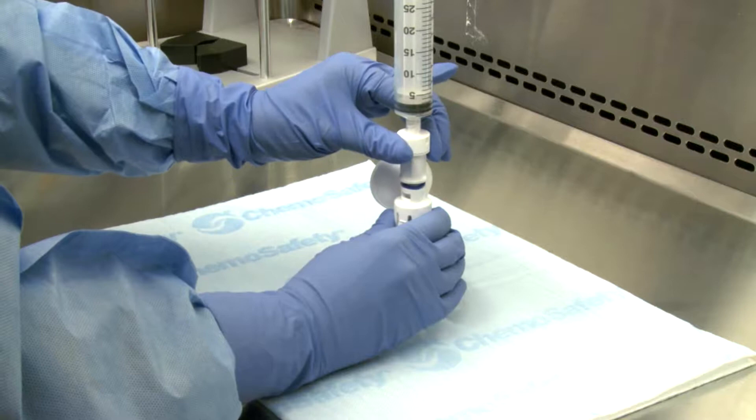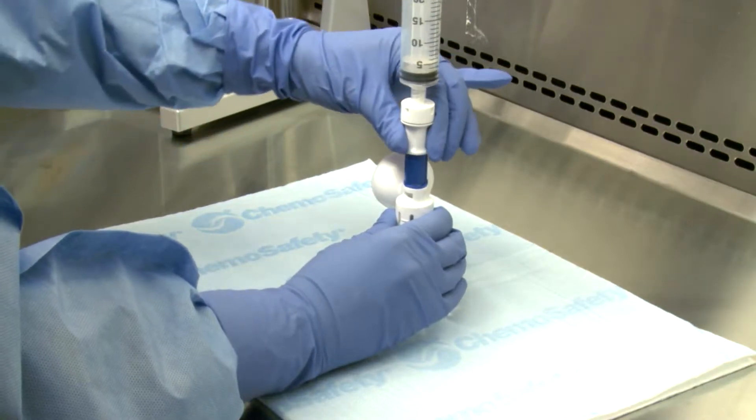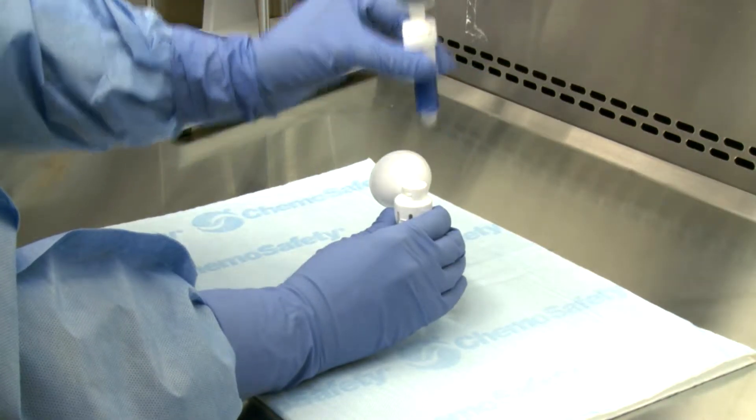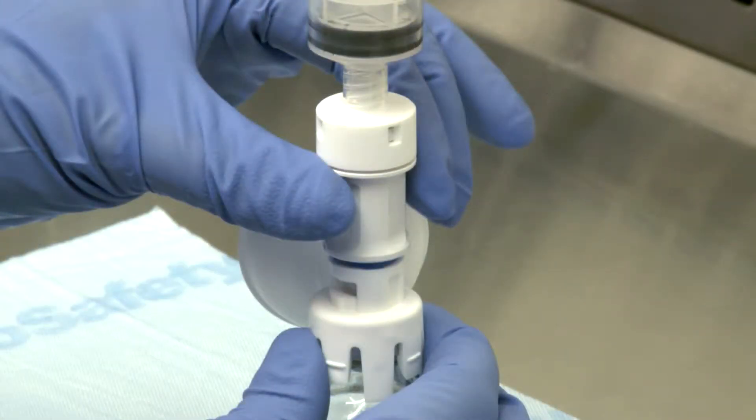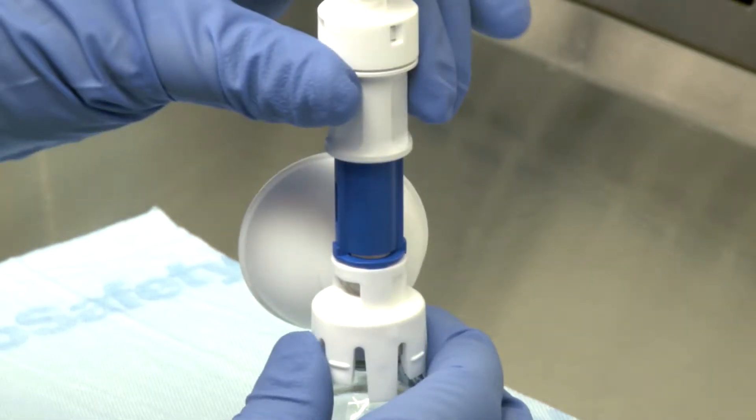To disengage the BD-Facile injector from a mating component, pull, turn, and pull. First, hold the injector at the white finger grips and the white portion of the mating component. Next, pull the injector back from the connection interface until it stops, exposing the blue portion on the injector, being sure not to touch the blue portion.